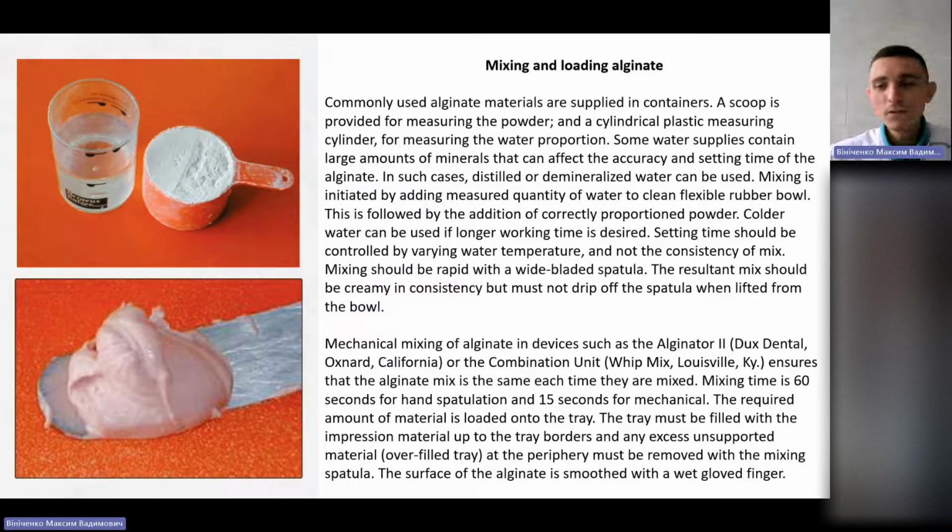That is one way. Another point is that patients have different sizes of jaw. For example, if the jaw is really wide, this portion of material may not be enough to make a right impression. So we need to make a bigger portion. But theoretically, they will make it this way.